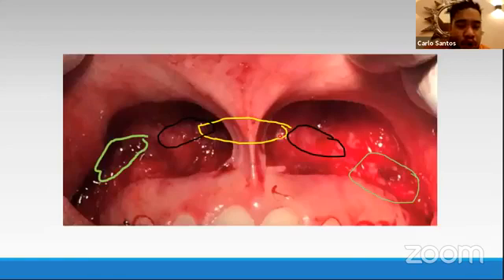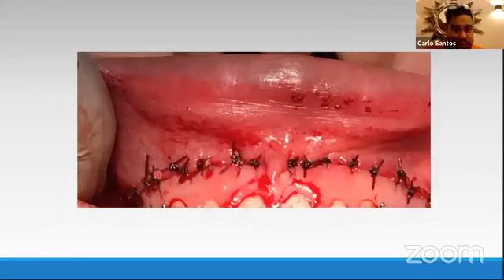Again, the suture you're going to use, of course, must be a resorbable suture. Underneath here, of course, you're going to leave it under, so you let it resorb there. Interrupted suture is done. You can do continuous, but sometimes if it's not properly done, one nick in your continuous will continuously break also. So might as well do your normal surgeon's knot suture. And then irrigate with saline after.